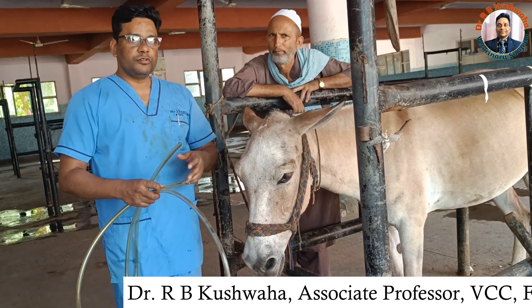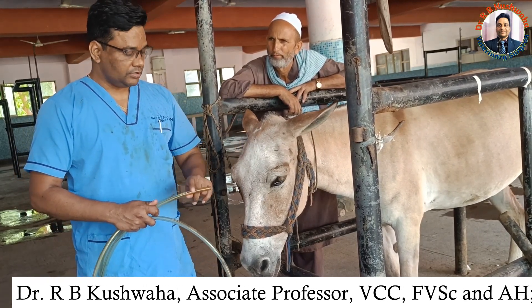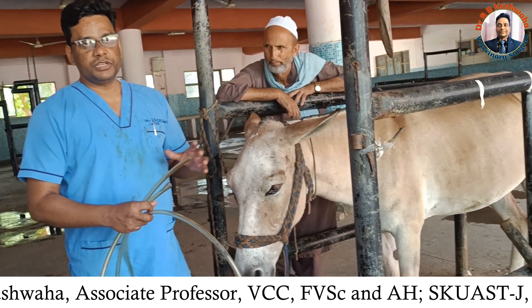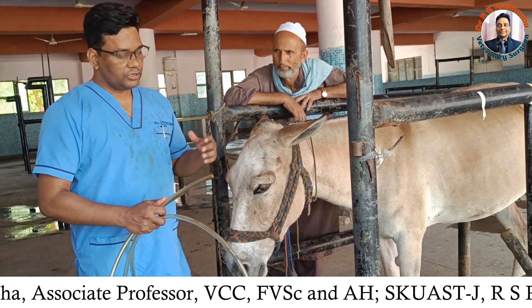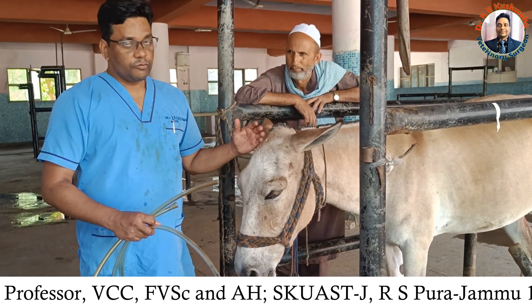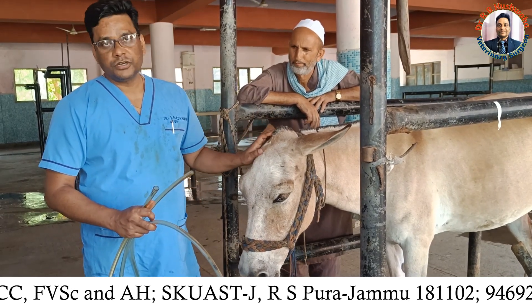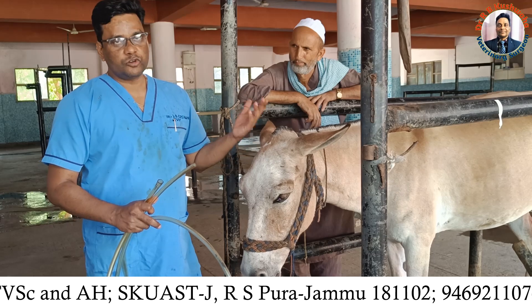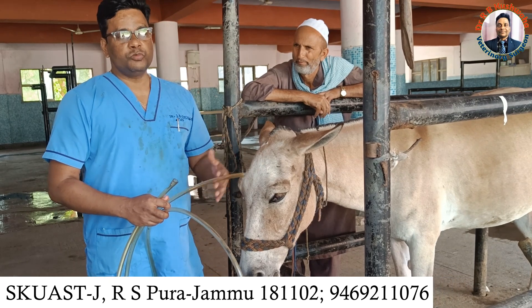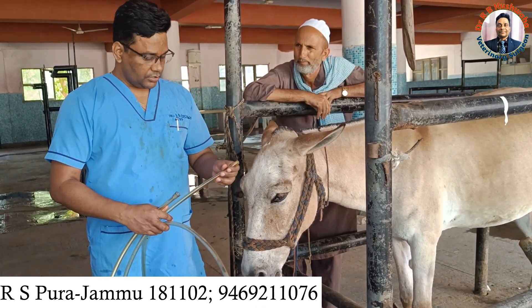As far as the indications of naso-gastric intubation are concerned, we normally perform this procedure for decompression purposes. That means if there is a distension of the stomach and you want to evacuate it, this tube is required. Even if you want to administer medicines, you need to pass this tube. In colic cases especially, there is a fair chance of accumulation of ingesta in the stomach.